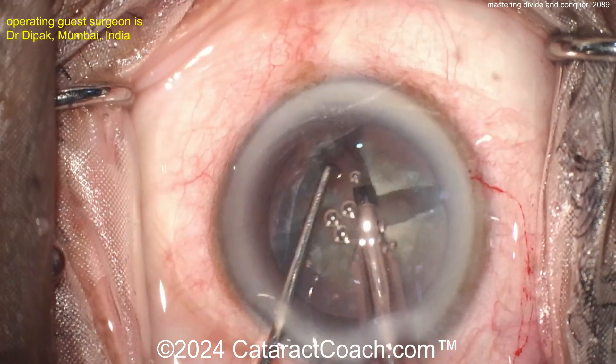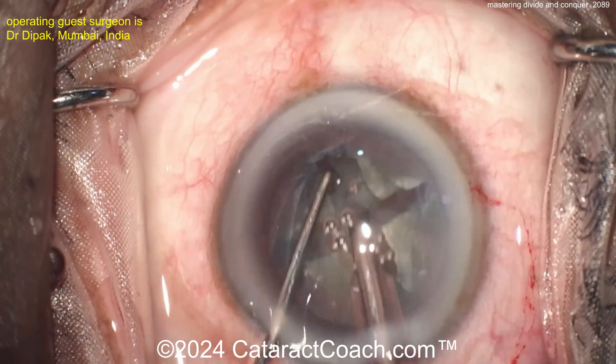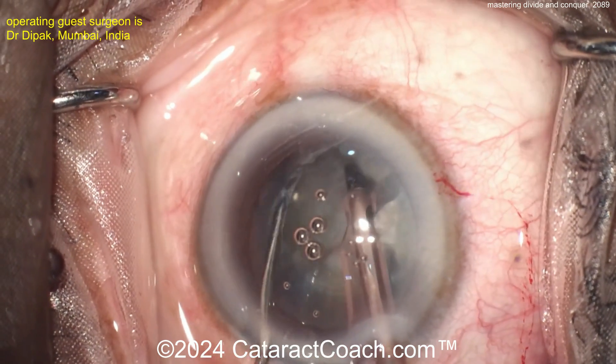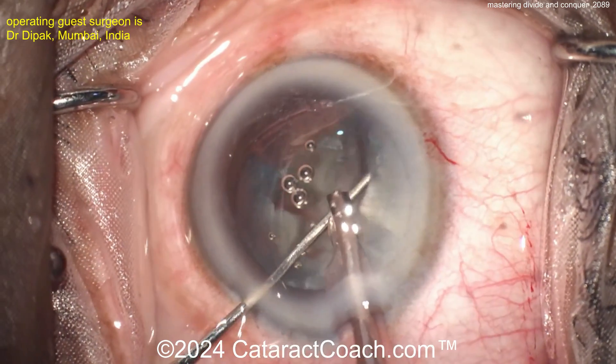Here's the last of the grooving — two long grooves but four groove segments. Now look: split them apart — you saw that crack. Make sure you can crack it all the way through to the posterior capsule. Don't worry if they're attached centrally; that'll open up once you get all these completed. Very nicely done — and then one more. There are all four quadrants now.